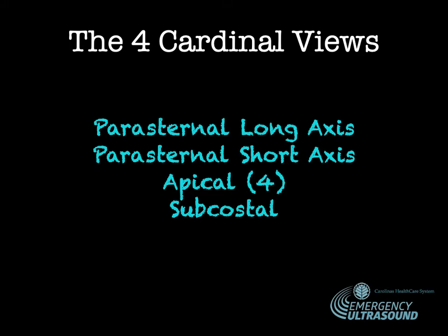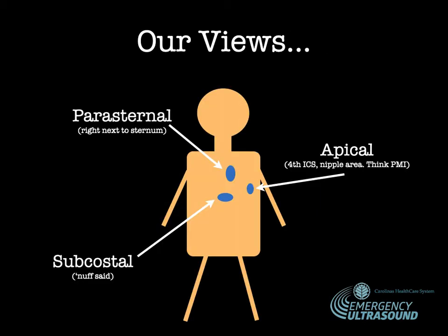So what are our four cardinal views with point of care cardiac echo? Our first view is our parasternal long axis. Our second view is our parasternal short axis. Our third view, apical four view, and then finally we have our subcostal view. The thing I love about each of these names is that they tell you exactly where you're supposed to place your probe. So in our parasternal short and long axis, we are placing our probe on the patient's left, but right next to the sternum.